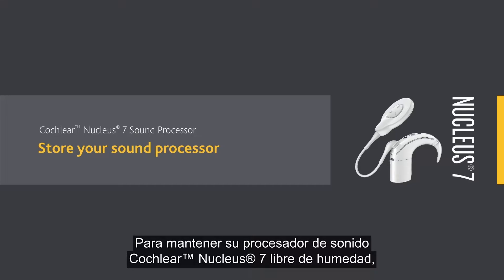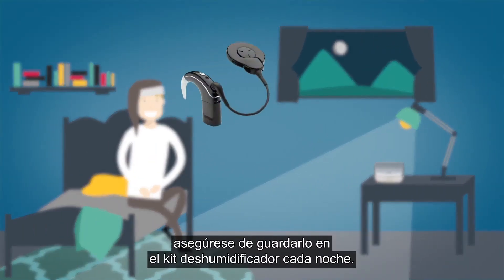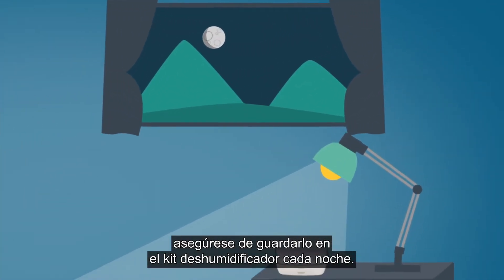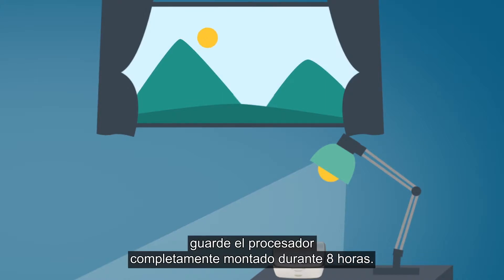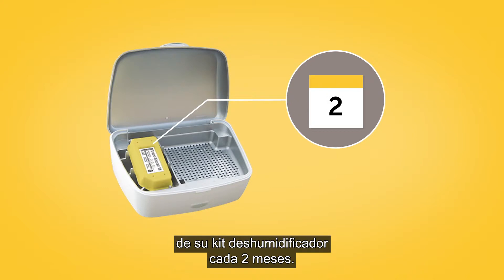To keep your Cochlear Nucleus 7 sound processor free from moisture, make sure that you store it in your DryAid kit every night. For optimal drying effect, store your processor fully assembled for eight hours. You should replace the moisture absorbing dry brick in your DryAid kit every two months.